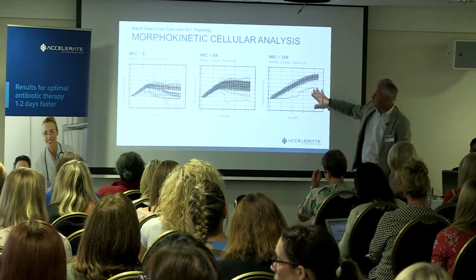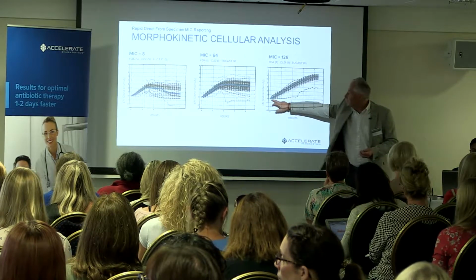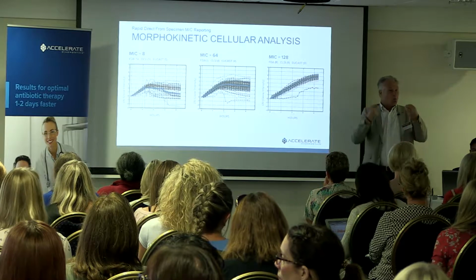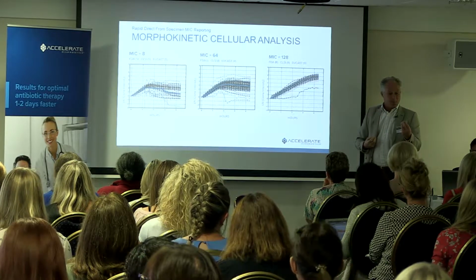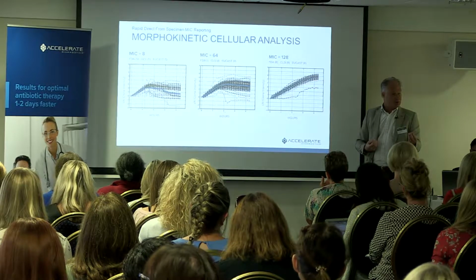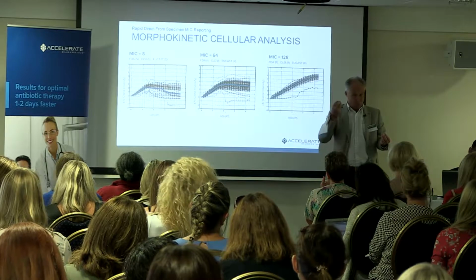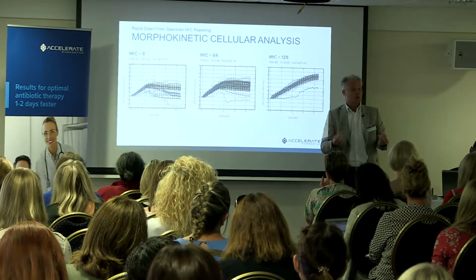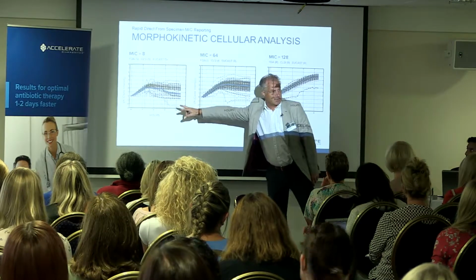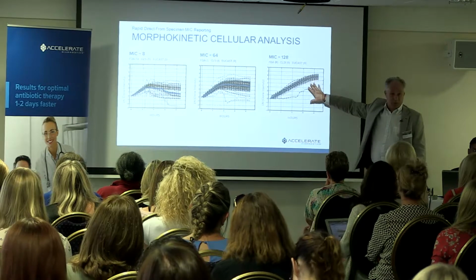Now here, for instance, you see clone intensity, let's say the amount of clones developing from that sample in the 4.5 hours. We have a growth control where the bacteria grow without the presence of antibiotics, and we expose them to a certain critical concentration, a single concentration. Depending on their resistance profile, they will develop differently, and we analyze these developments. This is just one of the parameters.